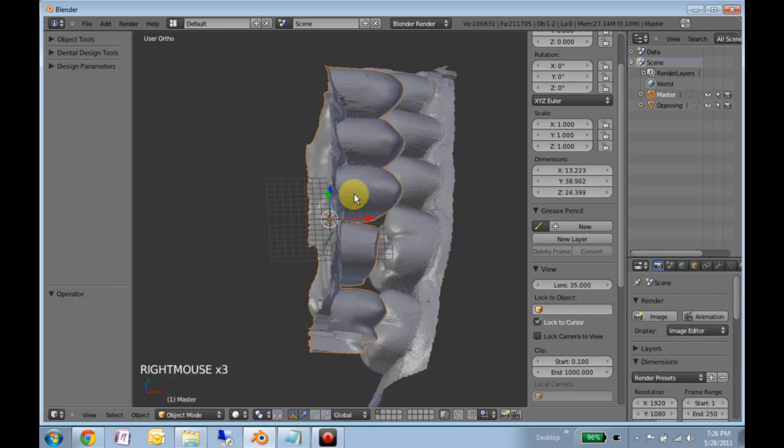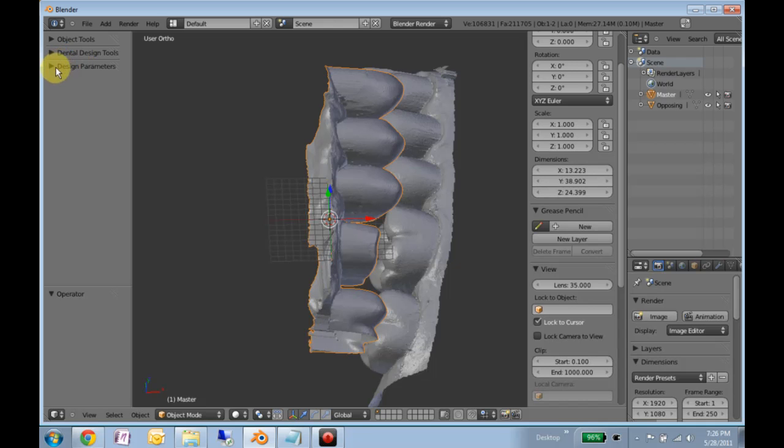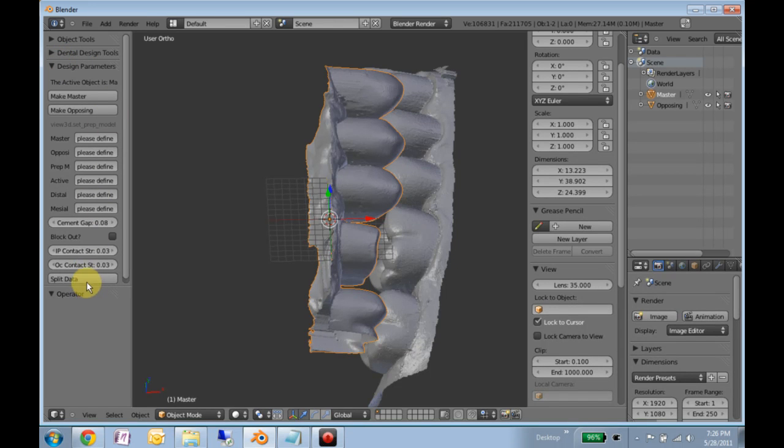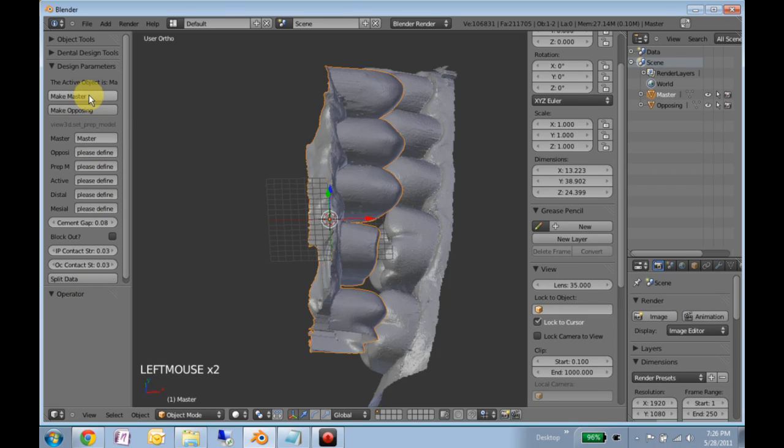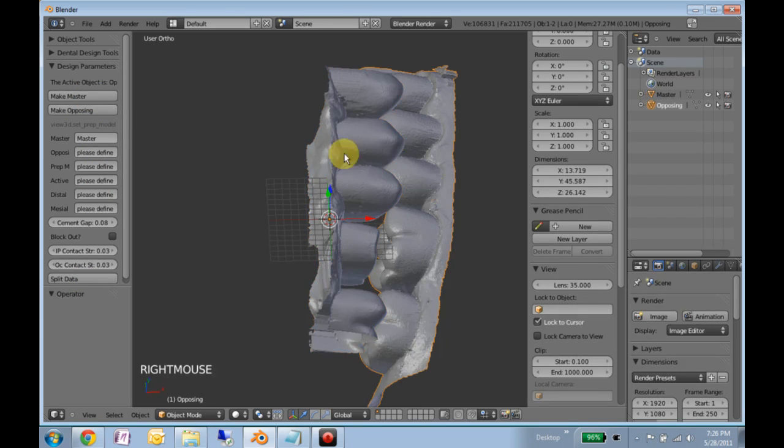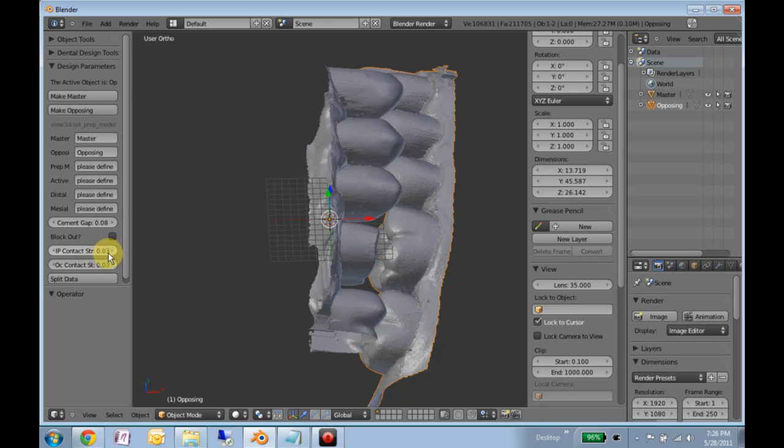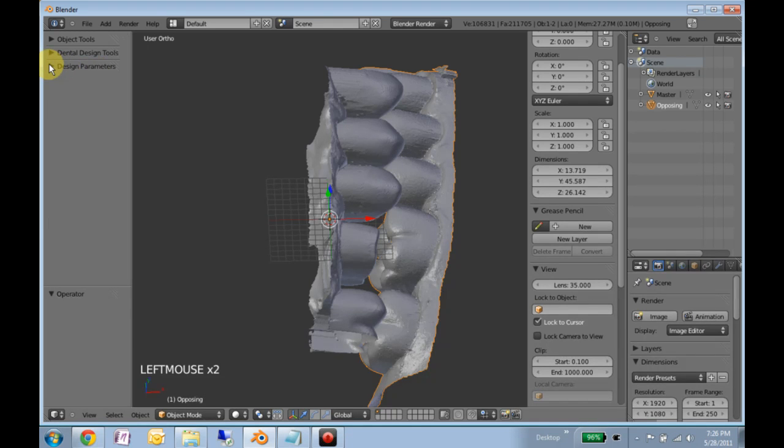What we'll do is we'll right-click our model that has the preparation on it. Go to design parameters. Also, a lot of these buttons are legacy. I'll be cleaning some of them out. We'll make that the master model. We'll let it know that that is the opposing model. We can set our cement gap distance and the strength of interproximal contacts. But for now, just as a learning exercise, we'll skip that.